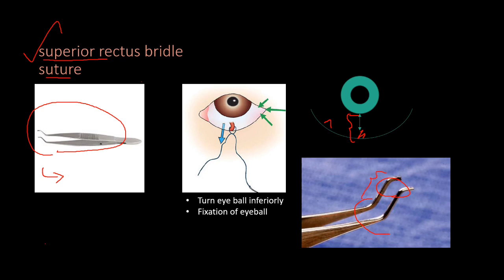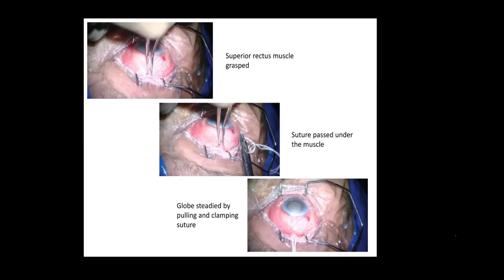The distance from the limbus to the superior rectus tendon is 7.7 mm. In the forceps, this distance is also 7.7 mm. We keep this end at the limbus and catch the superior rectus tendon. The suture is passed below the tendon so that the eyeball is placed downwards and fixed.